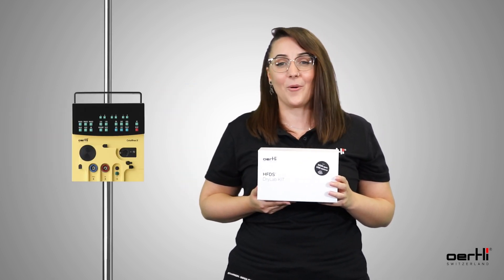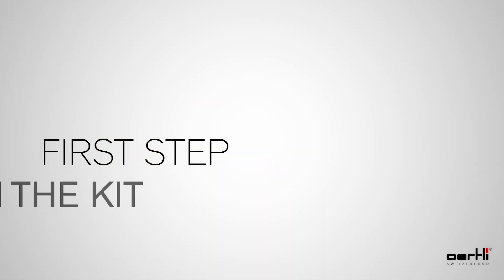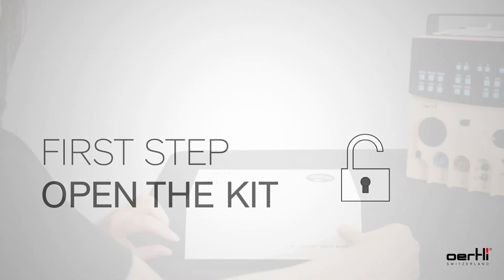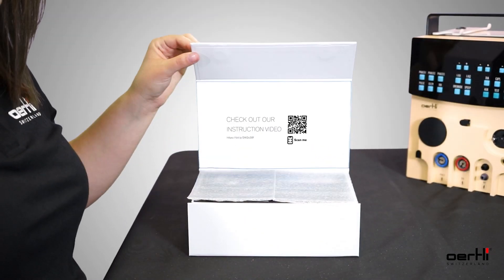Let's have a closer look at how it works. First step: open the HFDS dry lab kit. Thanks to the magnetic snap lock, we can open the box without much effort.